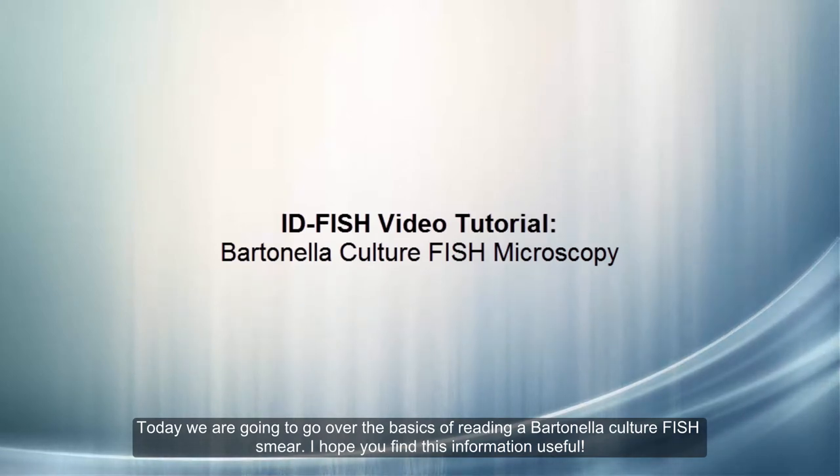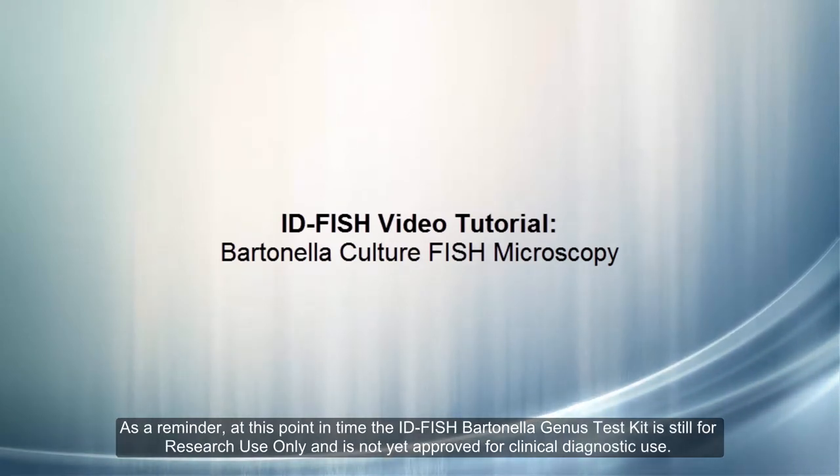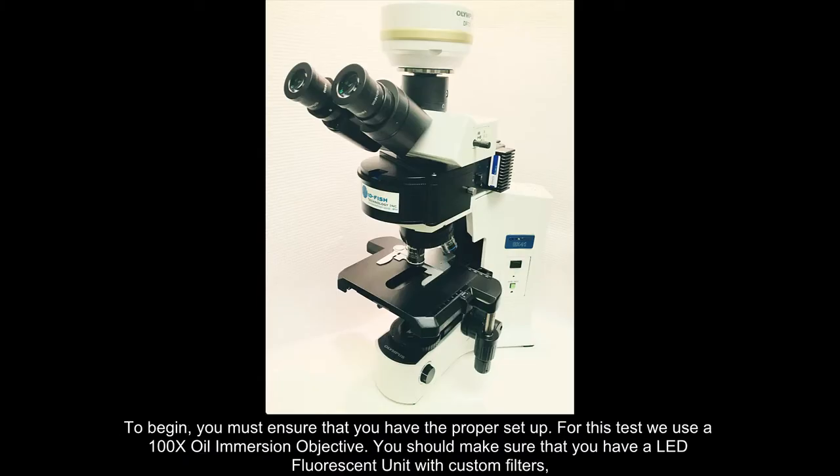Today we are going to go over the basics of reading a Bartonella culture FISH smear. I hope you find the information useful. As a reminder, at this point in time the ID-FISH Bartonella genus test kit is still for research use only and is not yet approved for clinical diagnostic use.